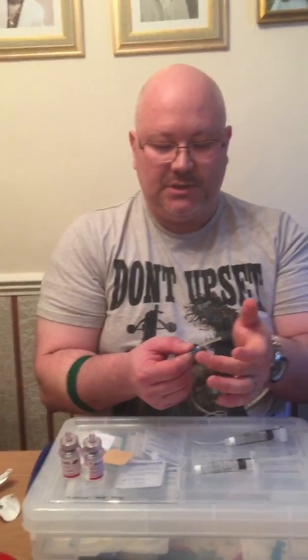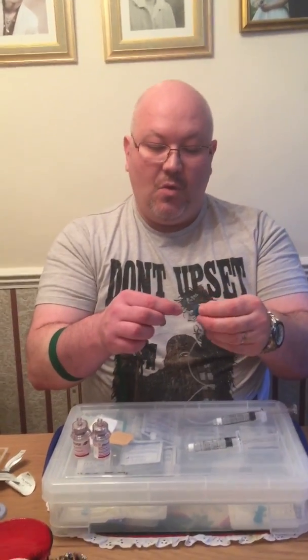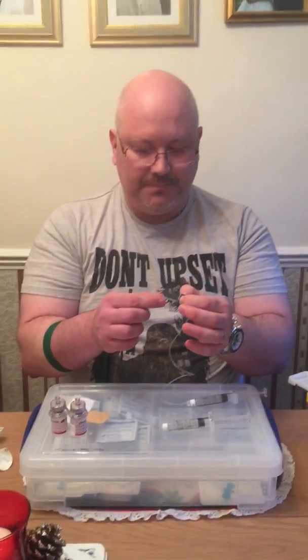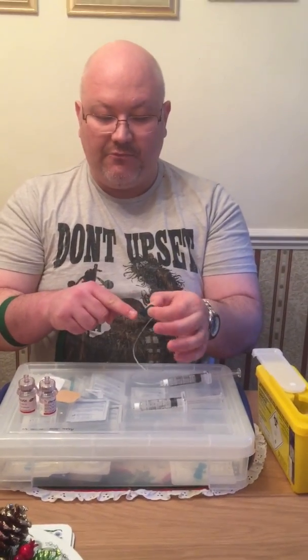Now take the needle — it's a butterfly needle, so you hold on to the wings of the butterfly. You have to make sure that the needle itself is the right way round. It's angled and you want the angle to be going down to a point, not up to a point, otherwise it's going the wrong way. You can either look at it, or this flappy bit here always goes over the needle on top, never underneath. Flip those wings up and hold it like this. Once I unsheathe the needle, I can't resheathe it because I might get a needle stick injury — that's where you stab yourself with your own needle. So I take the sheath off. That's now ready to inject.